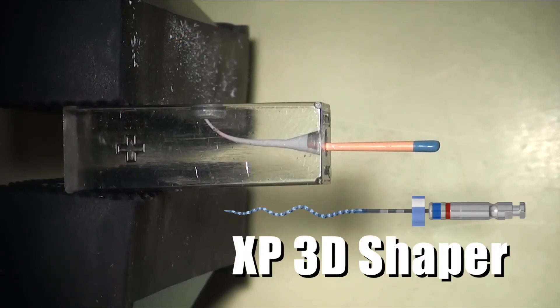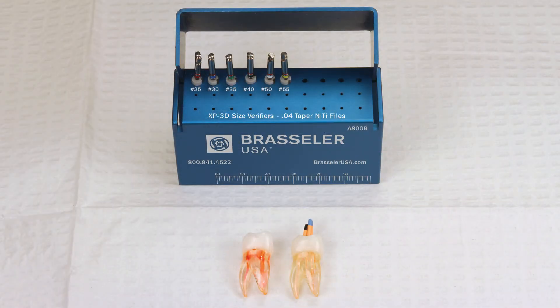The XP3D Shaper is unique because one adaptive instrument is doing the work of an entire series of solid core NITI files. This means that when instrumenting larger canals, we are going to have to gauge the apex in order to select the appropriate master cone.